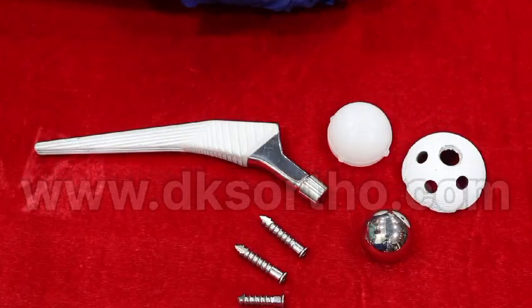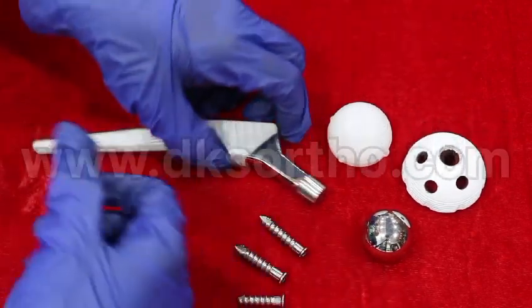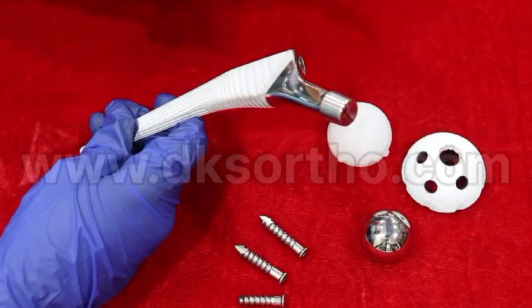DKS Ortho presents the total hip replacement system, uncemented. In this system we have an uncemented femoral stem. It is available in both stainless steel and titanium.